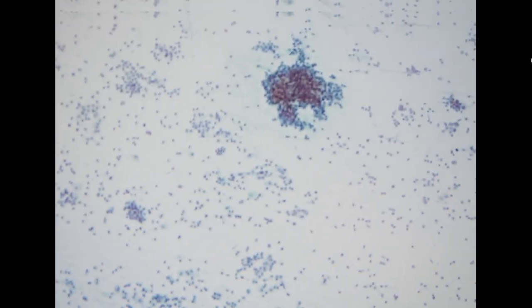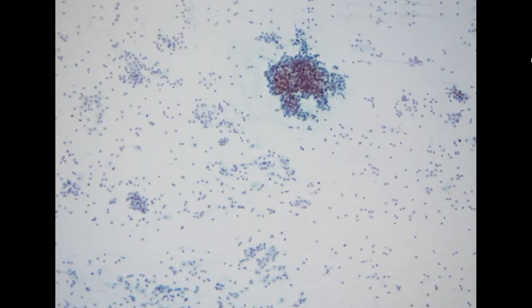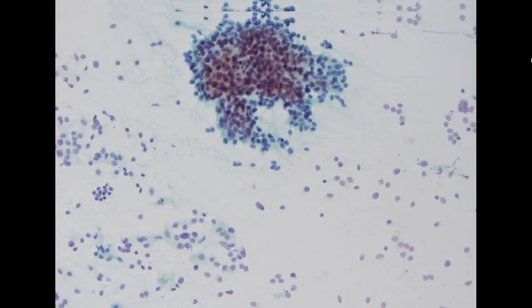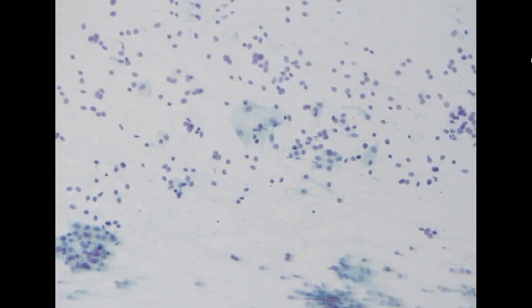I just want to show you the patient's prior smear from two years ago. Basically, it has a very similar pattern in the background: aggregates of larger fragments of high NC ratio cells, but with a homogeneous chromatin pattern, and a lot of naked nuclei. So this looks like an atrophic smear.